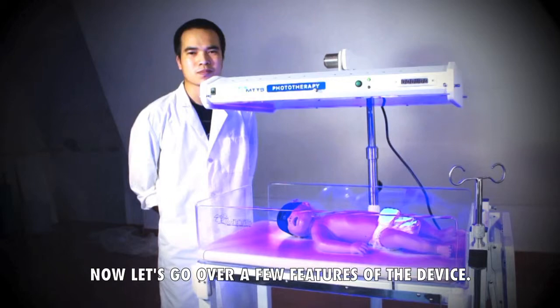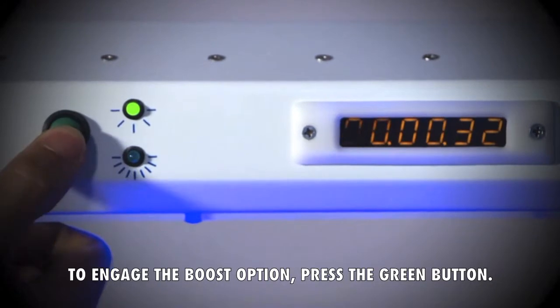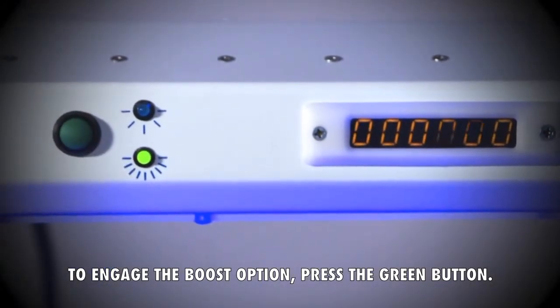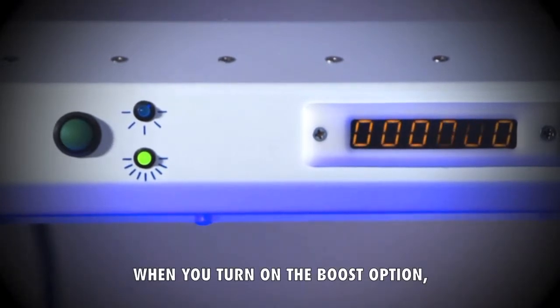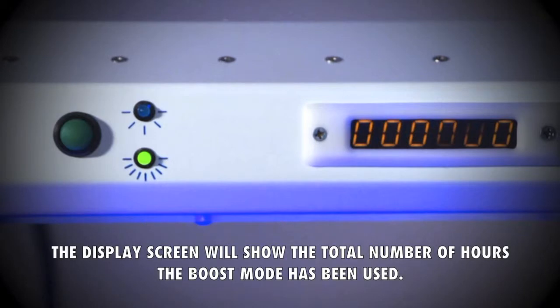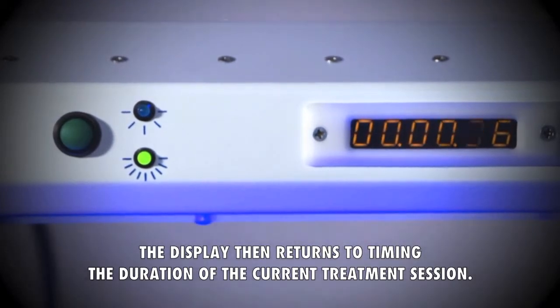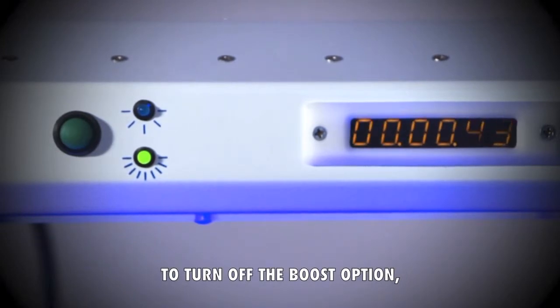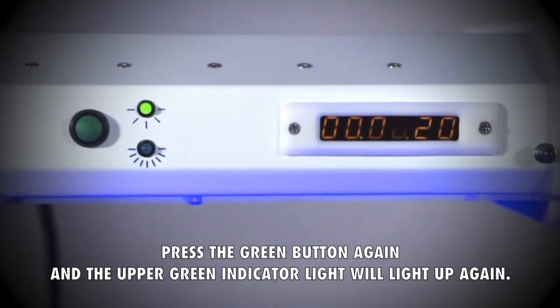For extra intensity, you can use the boost option. To engage the boost option, press the green button. The lower green light will light up. When you turn on the boost option, the display screen will show the total number of hours the boost mode has been used. This will display for the first three seconds, then the display returns to timing the duration of the current treatment session. To turn off the boost option, press the green button again and the upper green indicator light will light up again.